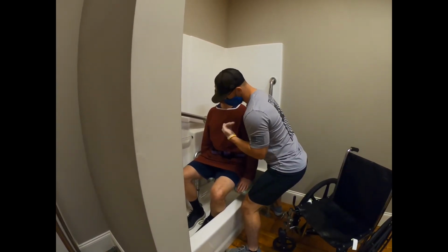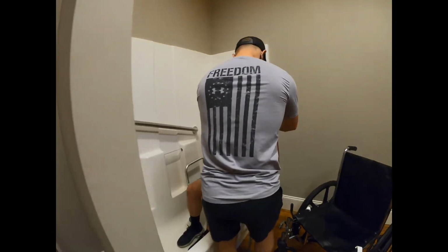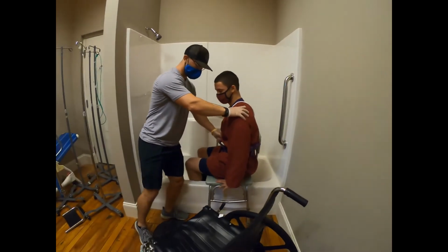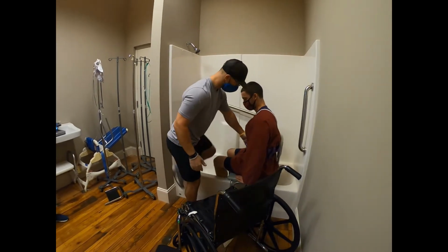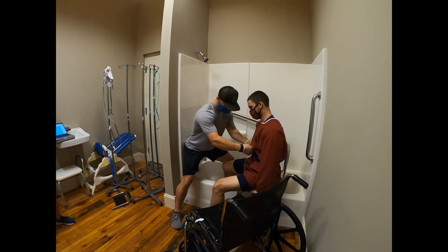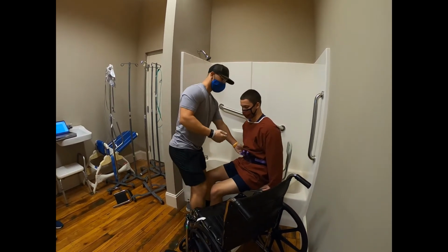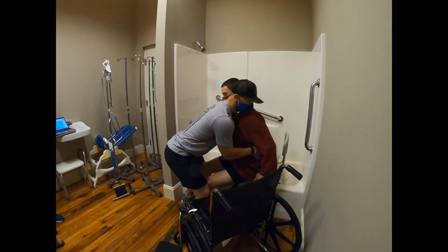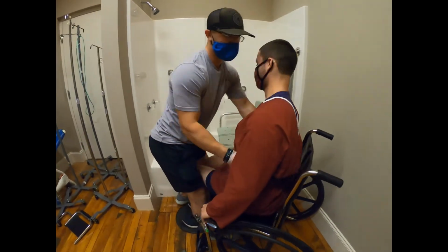When transferring the patient from the tub to the wheelchair, first begin with a lateral scoot towards the side of the wheelchair to get them in position for the transfer. Be sure that the wheelchair is locked and in close proximity to the patient for a smooth transfer. If necessary, place your foot in the tub if you feel safe and help guide their legs outside of the tub. Have the patient then lean towards you, grab tight onto their gait belt, and do a squat pivot transfer back into the wheelchair.